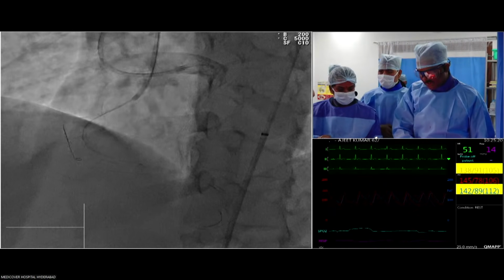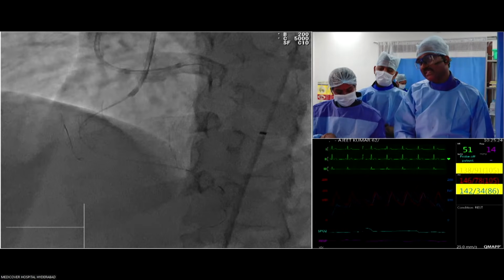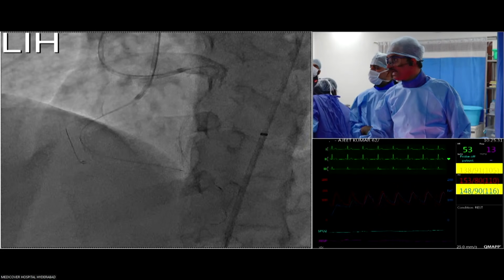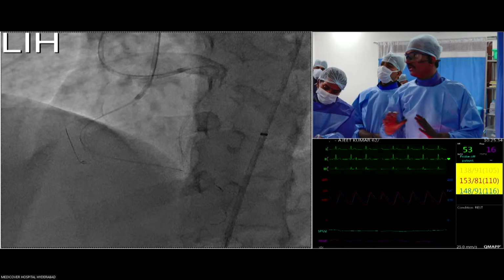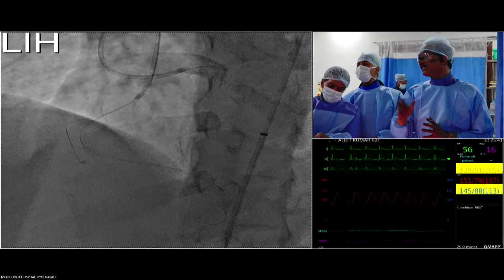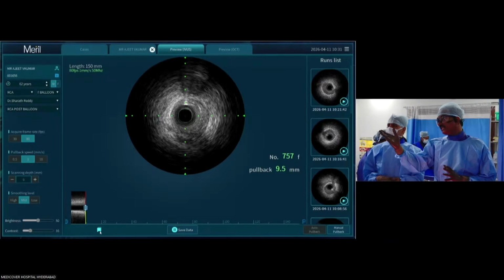No, see, I have been telling you about the distal vessel status in this case. The distal vessel here is a negative remodeling. It's not a diseased segment. That's a fundamental thing I'm talking about. You can see this is from the crux, I'm doing IVUS. You can see there is no plaque at all. So the vessel is pristine. You can see this is a bifurcation.